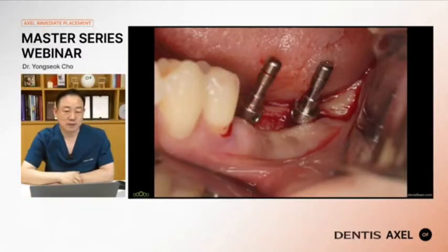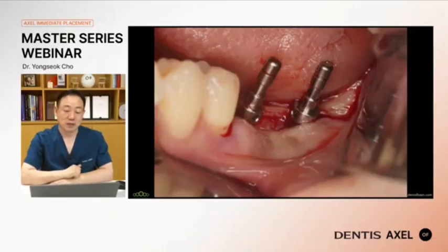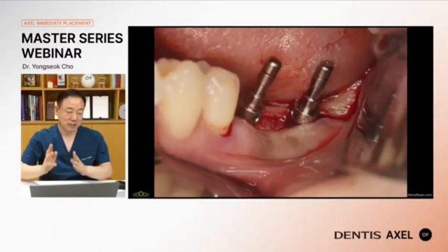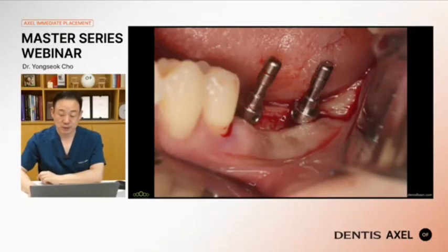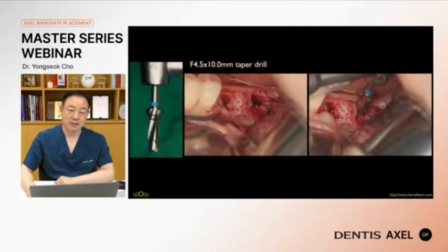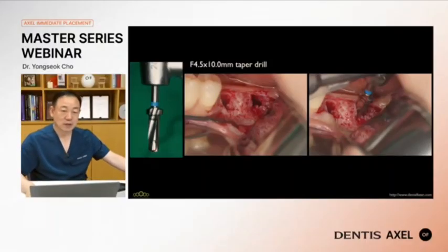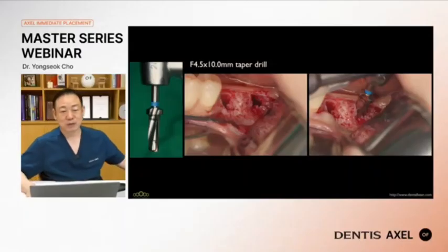Imagine the crown size is about 10 millimeters, then the first implant position is 5 mm away, and the second is about 10 millimeters from the first implant position, and it must be checked against the opposing dentition always. When the position and angulation look good, enlarge the osteotomy site. Depending on bone density, use the final drill. In this case I used a normal drill because it looks like normal bone.